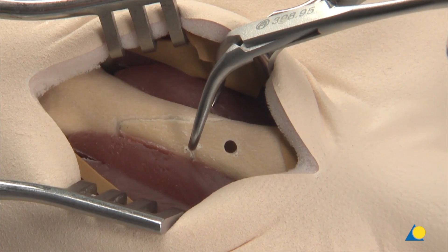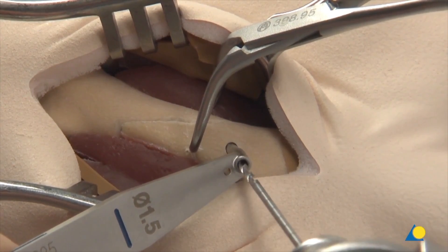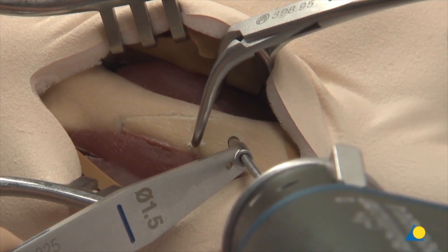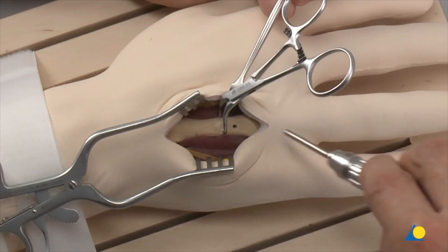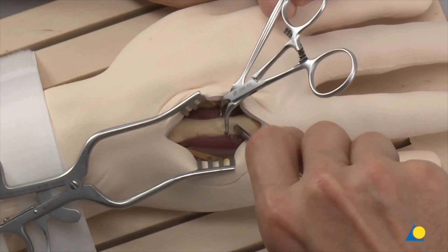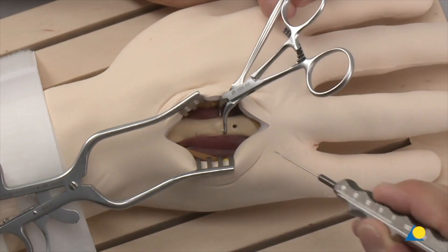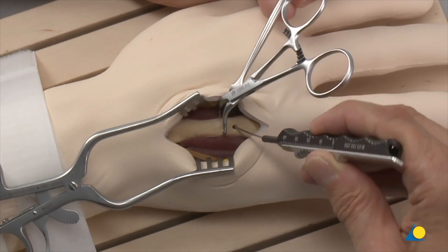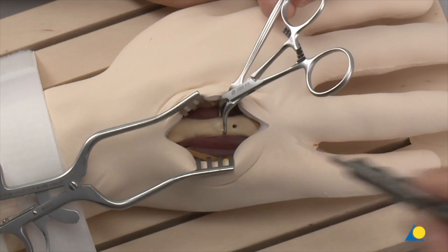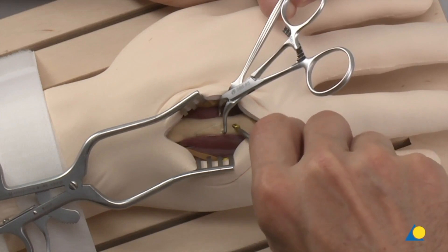The drill sleeve is rotated and the 1.5 mm sleeve is inserted into the gliding hole as an insert drill sleeve. The thread hole is drilled through the opposite cortex with the 1.5 mm drill bit. The near cortex is recessed with a countersink to decrease the prominence of the screw head and enlarge the surface in contact with the screw head in hard cortical bone. The length of the screw is determined with the depth gauge. The first 2.0 mm screw is inserted and the head is countersunk in the cortex.